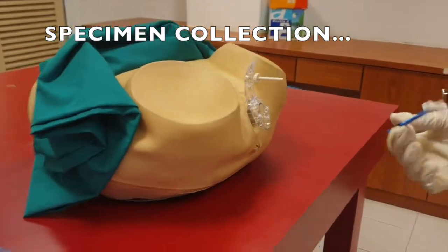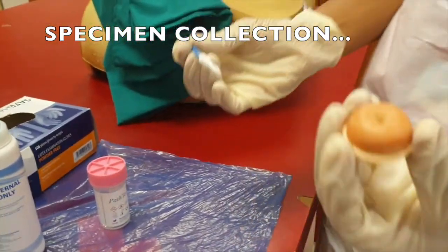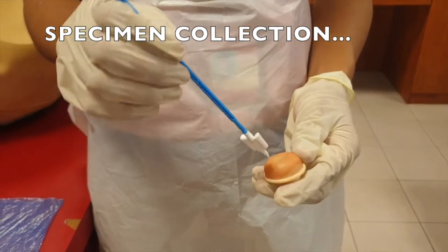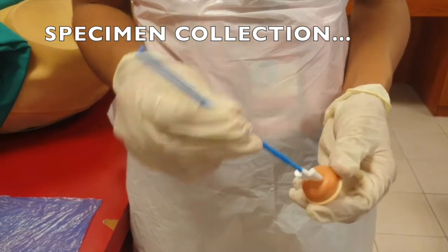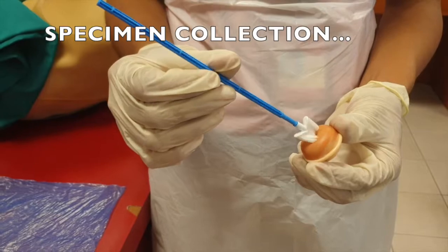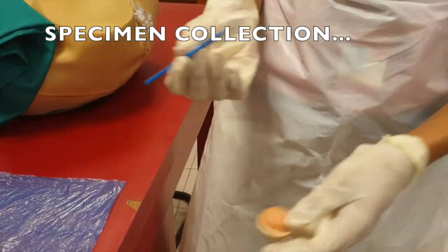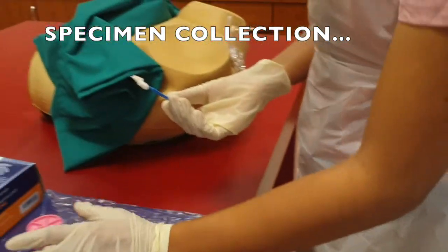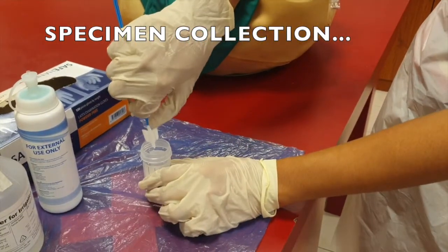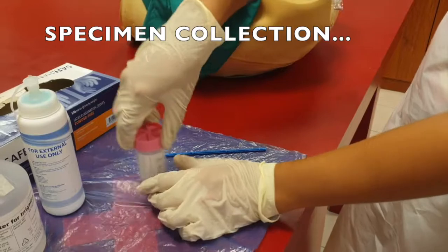For demonstration purposes, I will be showing you what happens inside the cervix. This is a sample cervix. This is your brush. We want to collect the specimen over here within the external os. Put it inside, make sure it contacts the cervix, and then you rotate the brush clockwise about 5 times. Once you've collected your specimen, you take your specimen container, open it, and then you discard the specimen from the brush into it. You close it, and you send it to the lab for further evaluation.